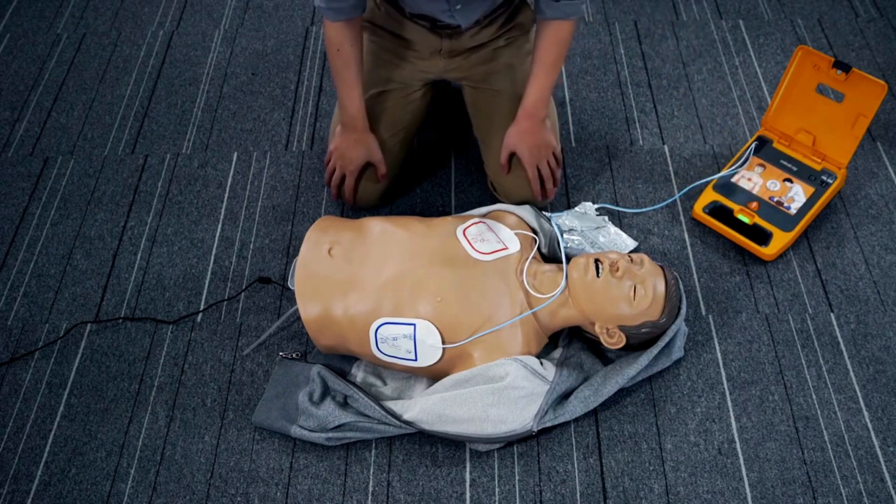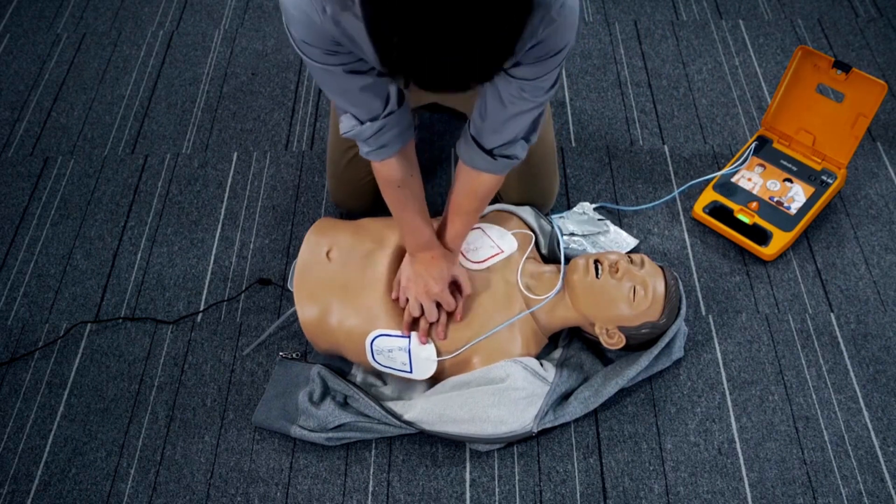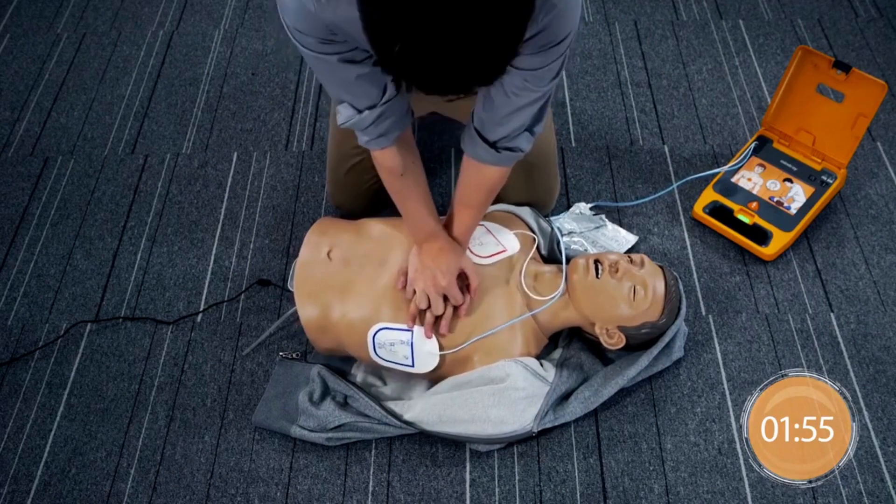Shock delivered. Start CPR immediately. Follow the metronome to give approximately 200 compressions.